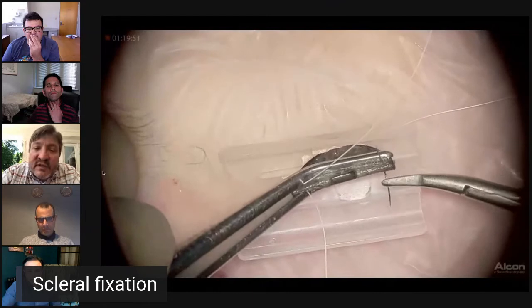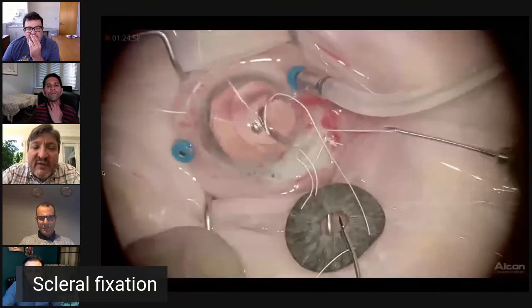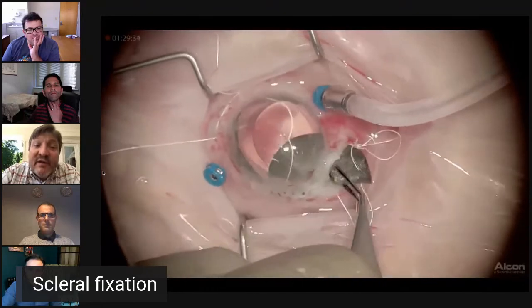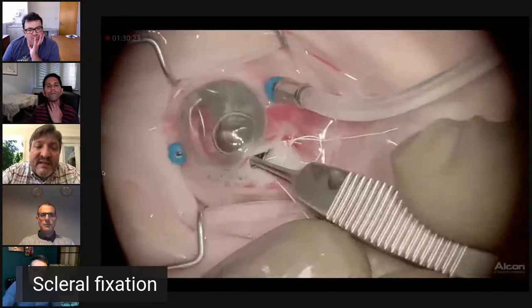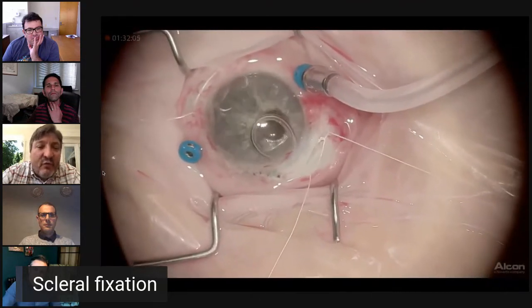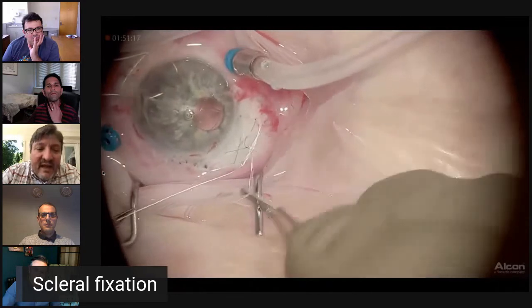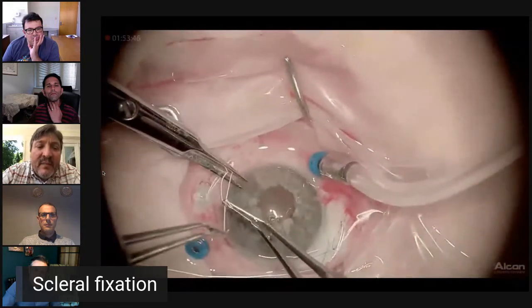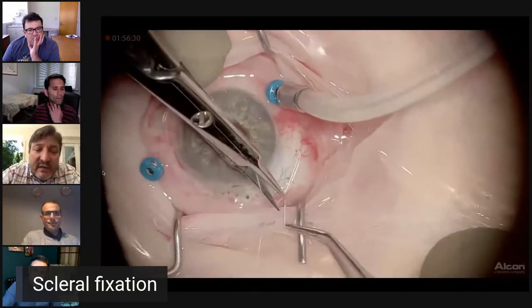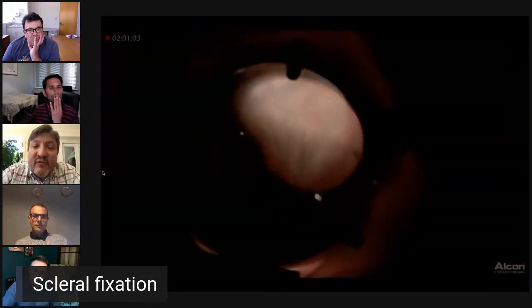I pass two Gore-Tex sutures through the artificial iris. I open it up. This is color matched to an index photo from the other eye. And you see that I'm recycling the same sclerotomies here to place the artificial iris suture fixation. The artificial iris unfolded upside down, unfortunately, but we were able to manipulate it back into place. And again, suture the scleral wound. And now we rotate the artificial iris clockwise and bury the knots intraocularly, recycling the same set of sclerotomies for both Gore-Tex sutures.